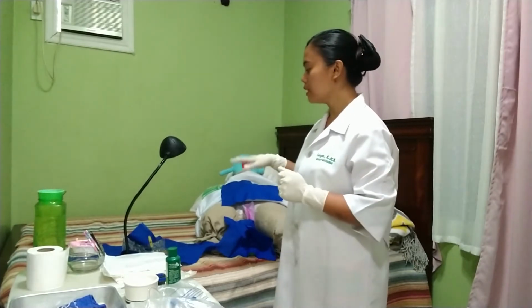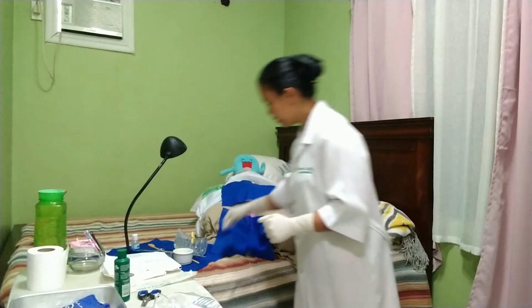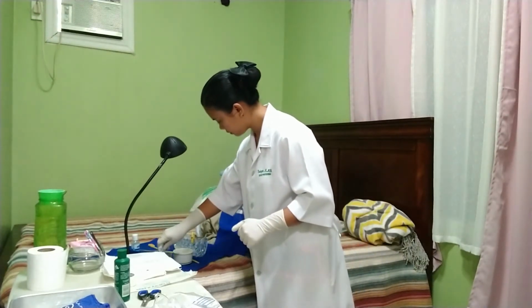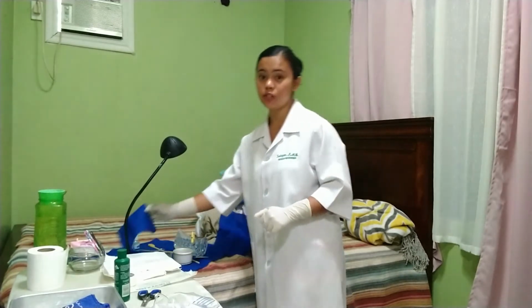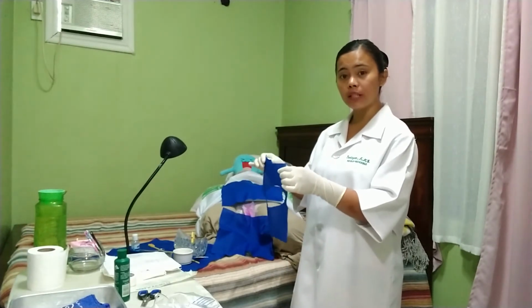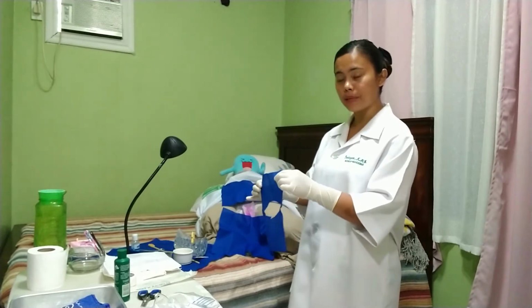Now that we have our gloves on, we may now touch things that are inside our sterile field and the one that's inside the catheter kit. So then we can drop the lubricant jelly on the sterile field and place the fenestrated drape over the labia of our patient. For a male patient, we have to drop it over the patient's groin area, exposing the penis or the urinary meatus of our patient.